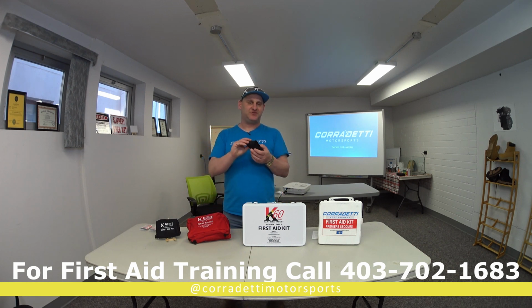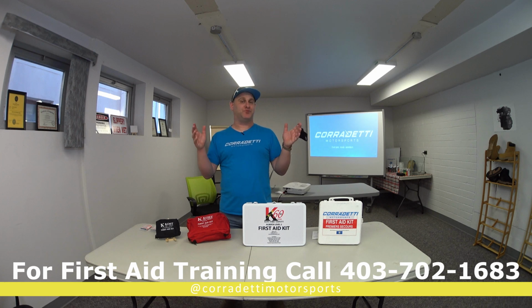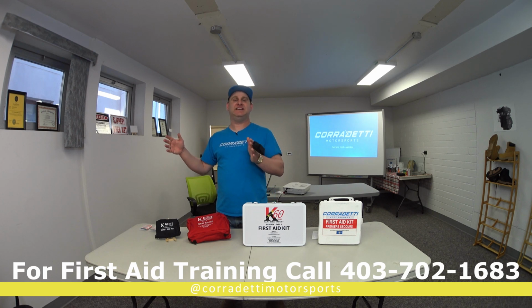and this one is not an actual first aid kit. It's actually a primary survey kit. So the primary survey, if you take first aid, is your breathing. We call it the A, B, C, and D. So that's what this kit is specifically for. It doesn't offer much more than to give the casualty first aid. So it comes with 3 items.